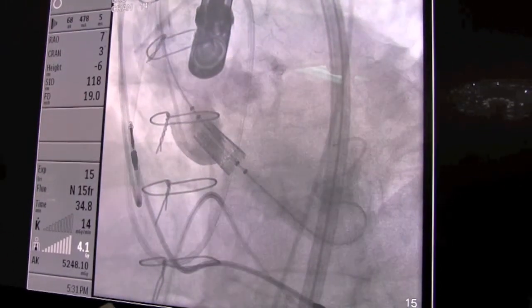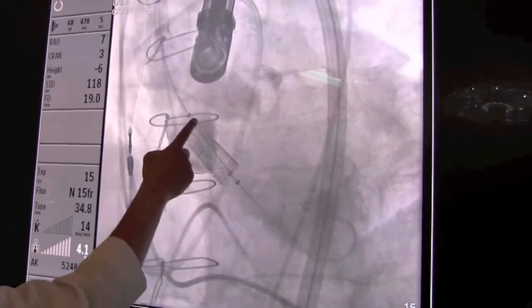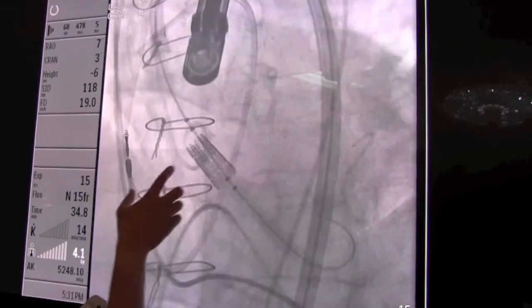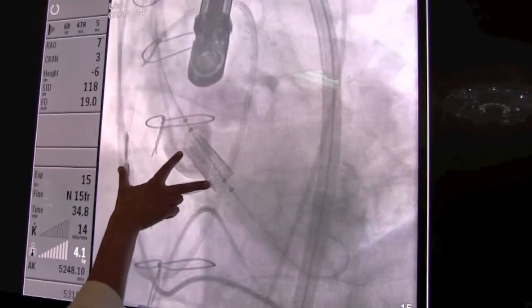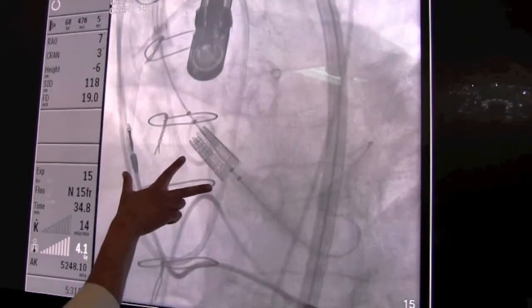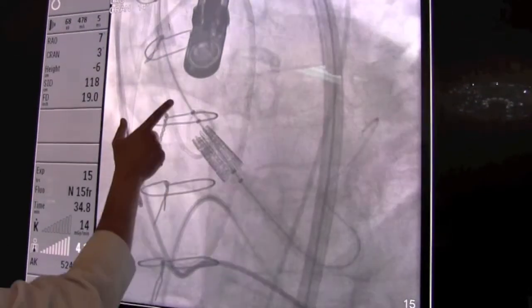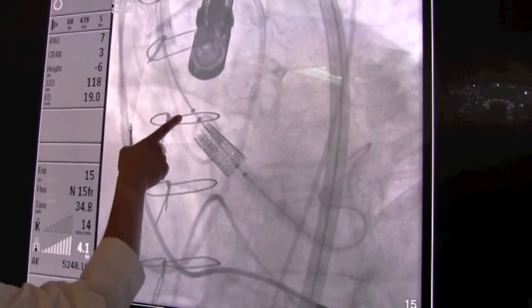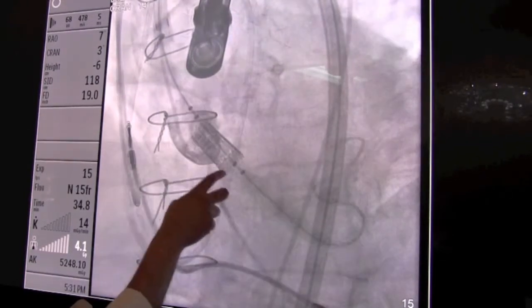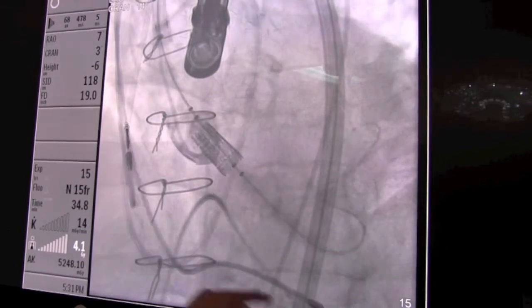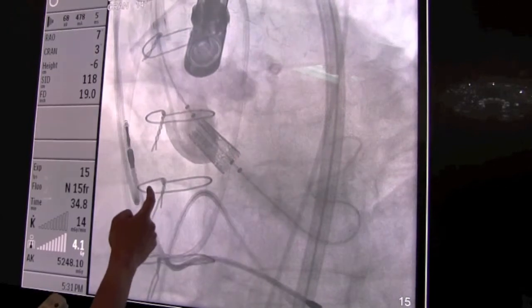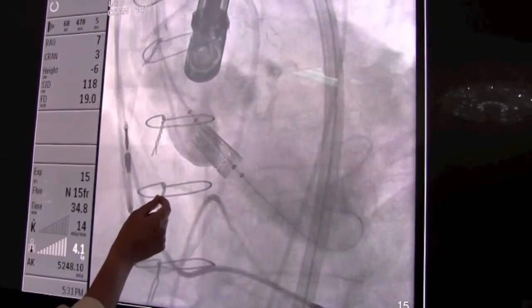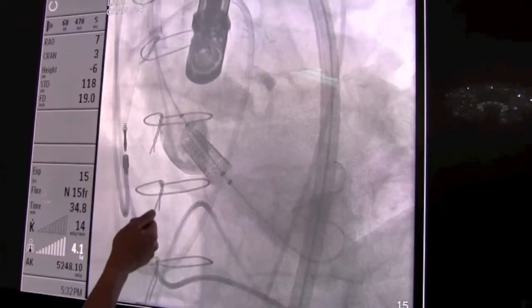This is really the business end of the procedure. We have a pigtail catheter through which we're injecting contrast to show the patient's native aortic valve — you can see the leaflets. Across that we have the Edwards transcatheter heart valve that you saw getting crimped on the back table, mounted on a balloon. We're delivering it from the patient's groin through that big sheath, coming around the arch of the aorta and halfway into the left ventricle across the aortic valve. You can also see his old pacemaker wires, the transesophageal echocardiography probe, and the patient's sternal wires from his prior bypass surgery where they wired the sternum back together.